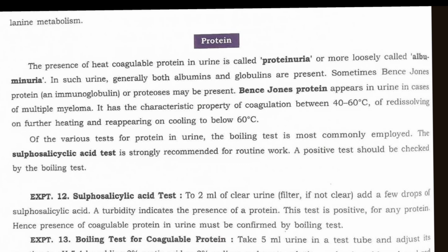Of the various tests for protein in urine, the boiling test is most commonly employed. The sulfosalicylic acid test is strongly recommended for routine work. A positive test should be checked by the boiling test.